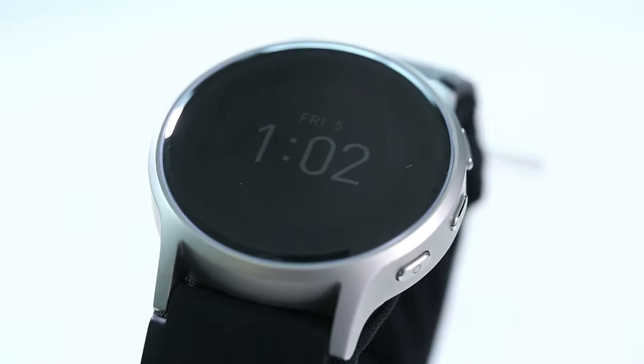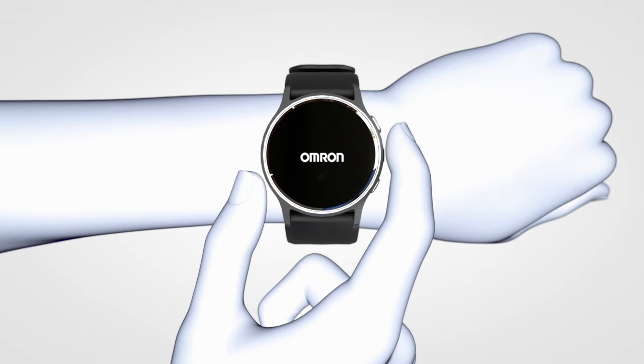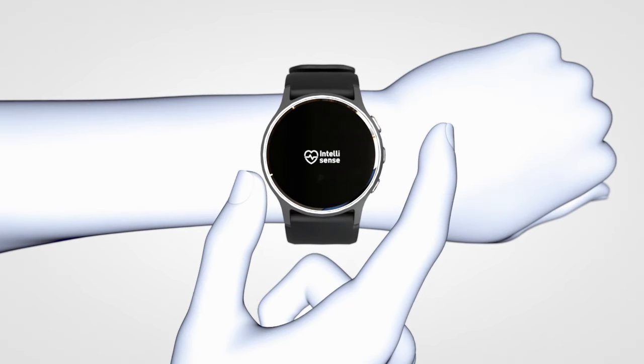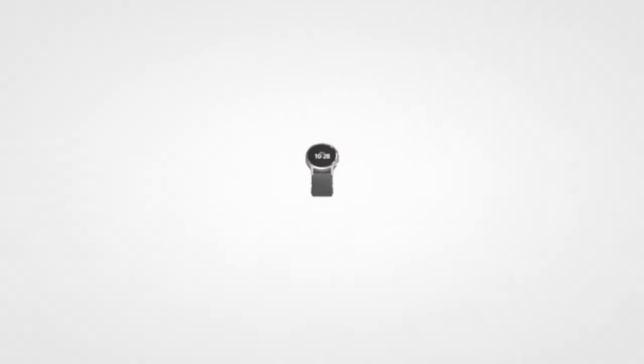The Omron Heart Guide combines the everyday usability of a traditional blood pressure monitor with the technology and convenience of a smartwatch. In this quick video, we demonstrate how to record accurate blood pressure measurements.